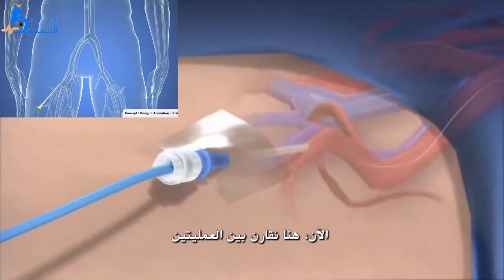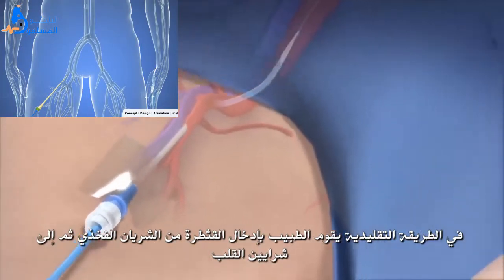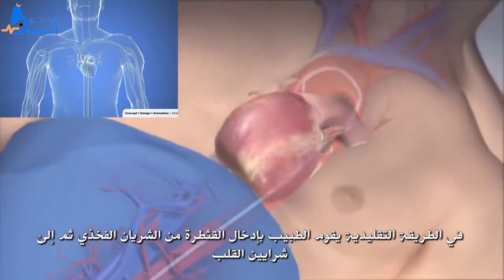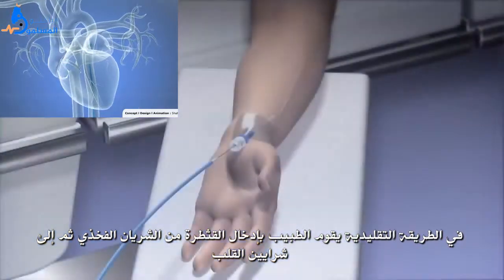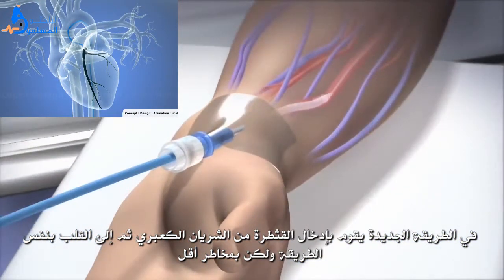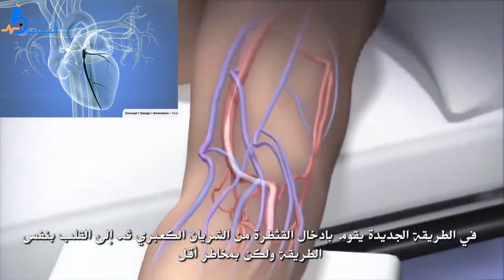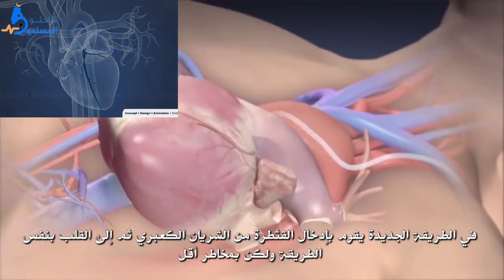Here's how the two procedures compare. For the traditional method, doctors place the catheter into the femoral artery and run it up to the heart. For the other method, doctors start at the radial artery in the wrist and thread the catheter to the heart. The access to arteries is the same, but with fewer risks.